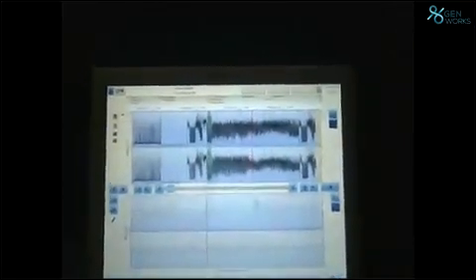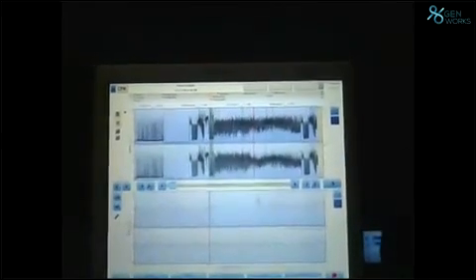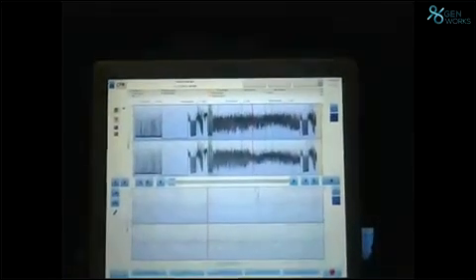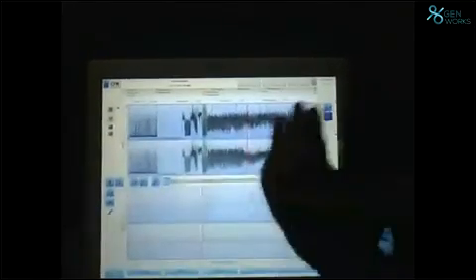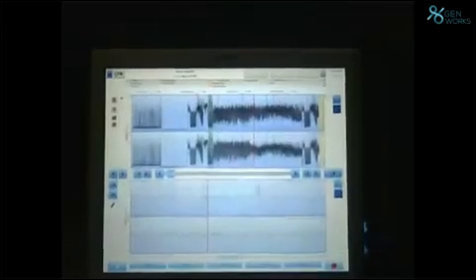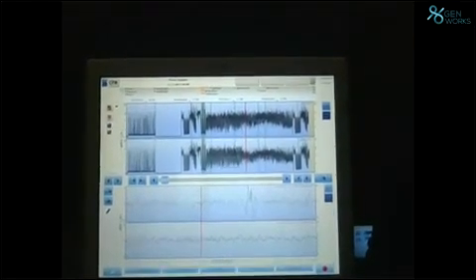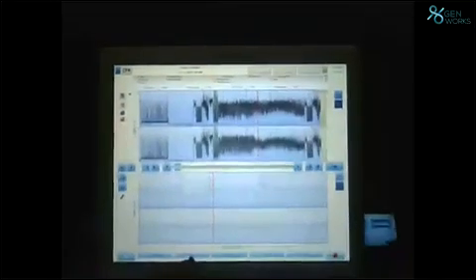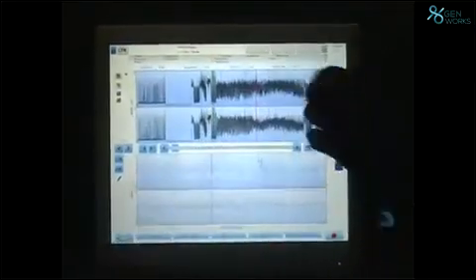So number one, all those things were there in previous machines. I mean, there was no artificial intelligence, so it was very difficult. But now, in the newer machines, to distinguish whether it is convulsions or an artifact, the machines are giving an option like this. Can you go to this, patient and marker? So the marker facility is here. You just have to select which particular one.